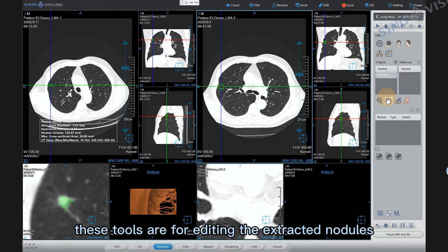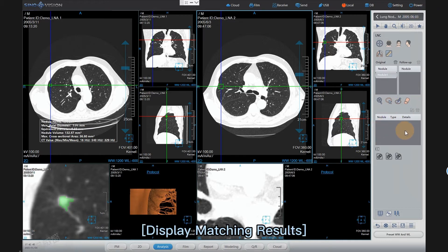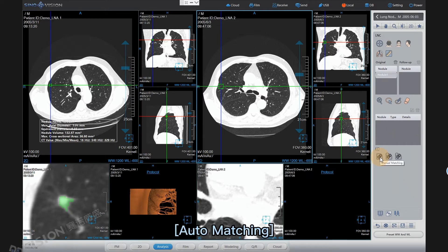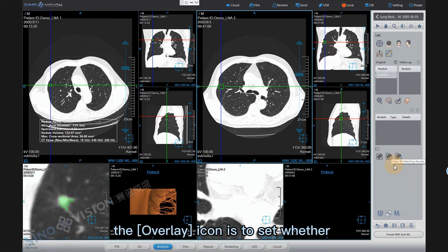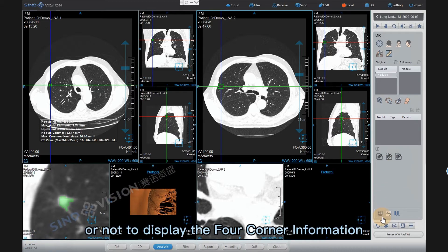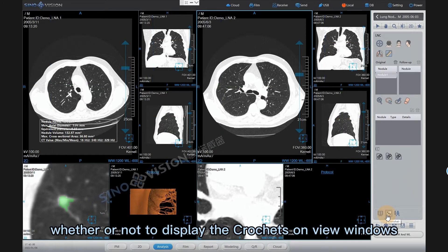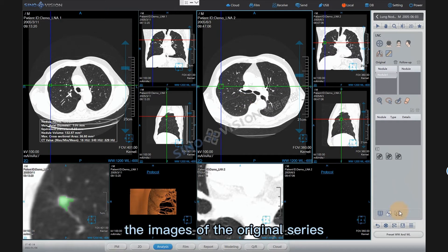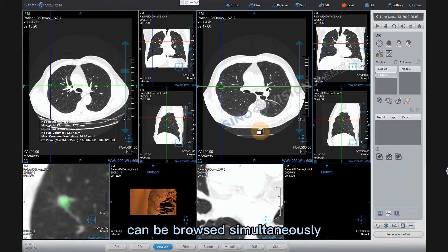These tools are for editing the extracted nodules. The nodule matching list displays matching results. Manual matching, auto matching, and clear all matching results options are available. The overlay icon sets whether to display the four corner information. The crosshair icon sets whether to display crosshairs on view windows. The synchronously rolling icon, when clicked, allows the images of the original series and comparison series displayed in the larger window to be browsed simultaneously.